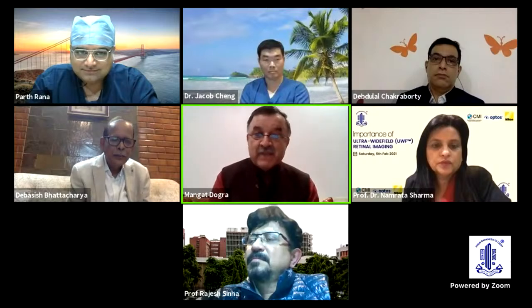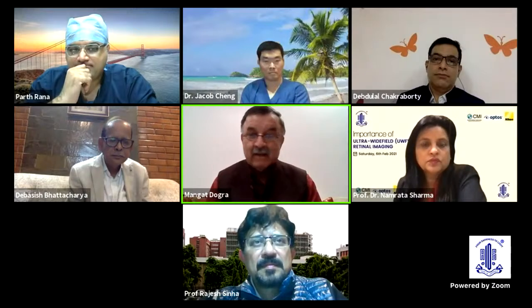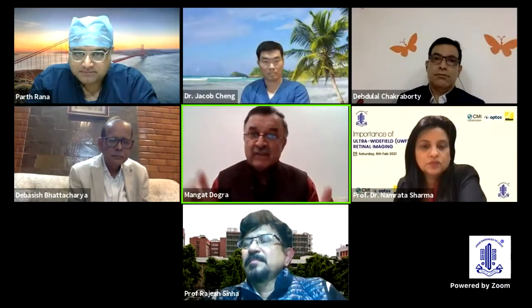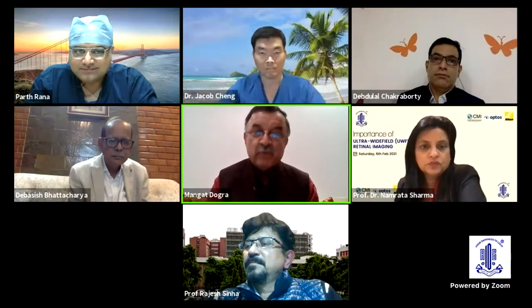Yes, Partha, as you said. Dr. Devashish, I want to echo the point which has been raised. This happens often, and it will happen more. The younger generation are not interested in doing all this examination with 360-degree depression, because it requires a lot of effort. And there are a lot of fallacies also. There might be an IOL sitting there, a cataract, or some other issues, and you may miss things. So it is not uncommon that we miss on examination what we find on imaging. I think the future absolutely is here, and that is the way we are going to be seeing patients in future.